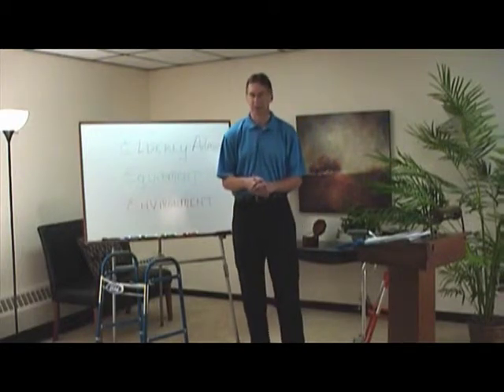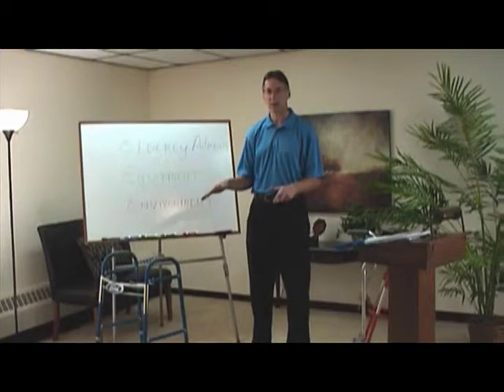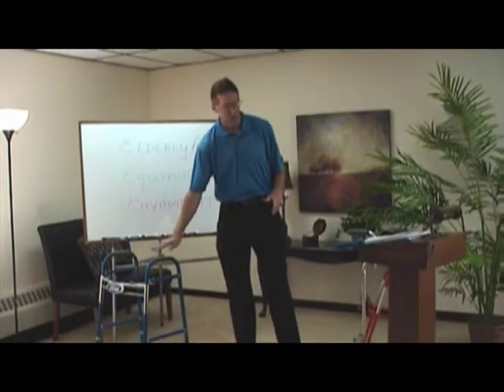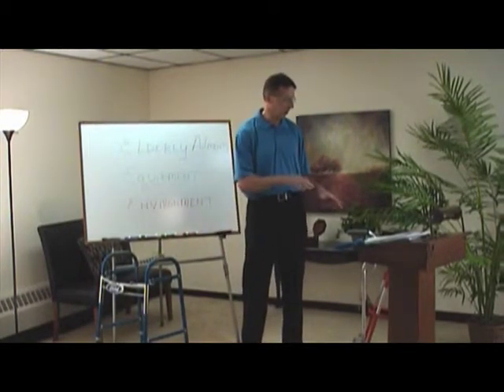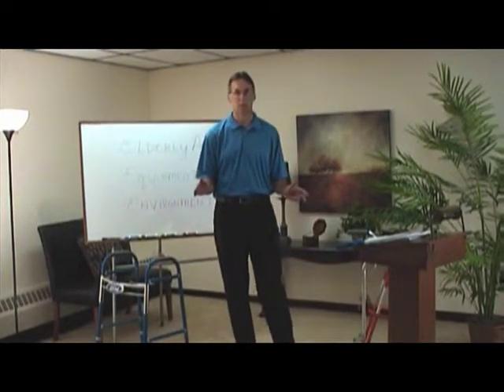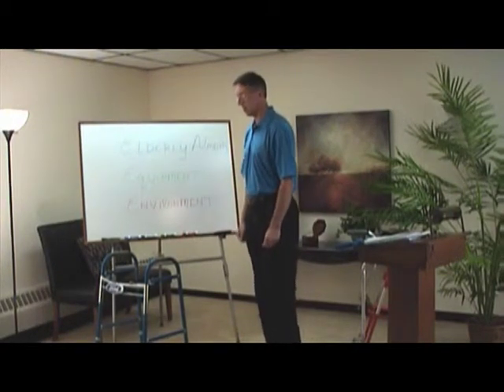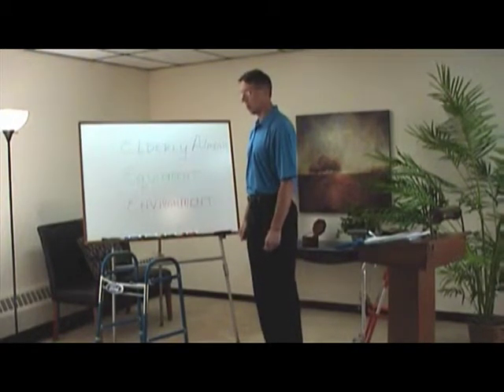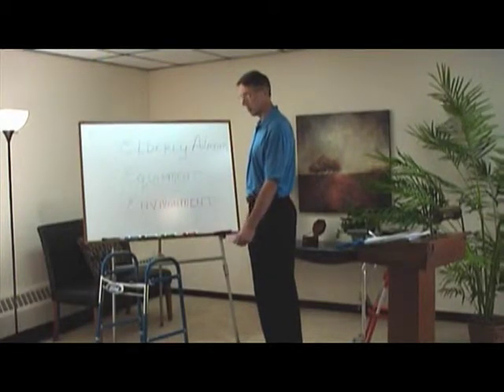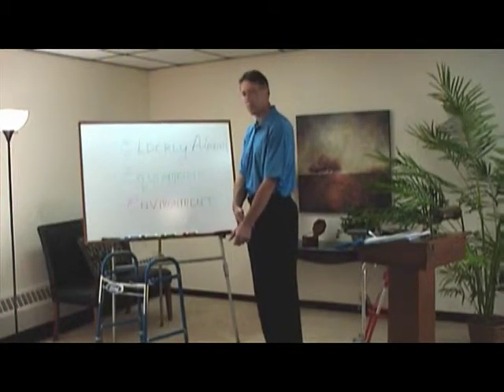Now I'm a tall guy, so unfortunately a lot of these won't even adjust up high enough for me. But whether it's a walker or a quad cane or a hemi walker or a regular cane, all the heights should be about the same. If you are standing with good posture and your arms relaxed at your side, and you bring your arm forward just slightly, the top of the walker or the top of the cane handle should hit you about on the wrist.